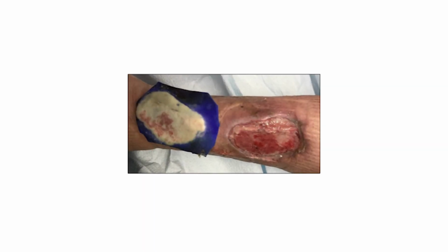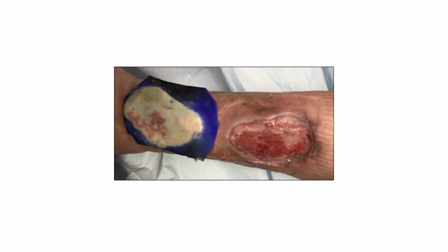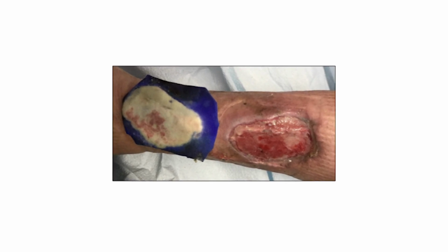So for instance, if you had a wound that was dry, when you hydrated the Hydrofera Blue you would leave some of the moisture in it and it would give moisture. If you had a wound that was wet, you squeeze out the excess saline when you hydrate it and put it in there, and it absorbs moisture. It also would tell you when it's done. It's killed as much bacteria as it can because it would turn white. Because it absorbs the bacteria into the foam and kills it in the foam. So therefore, when you take that dressing off and throw it away, the bacteria is gone.